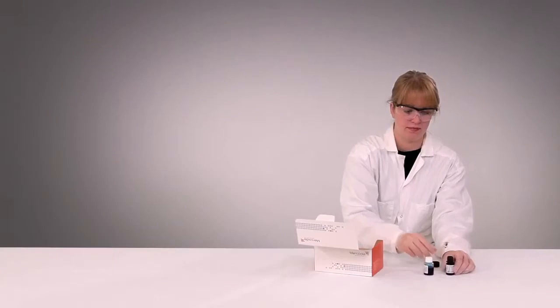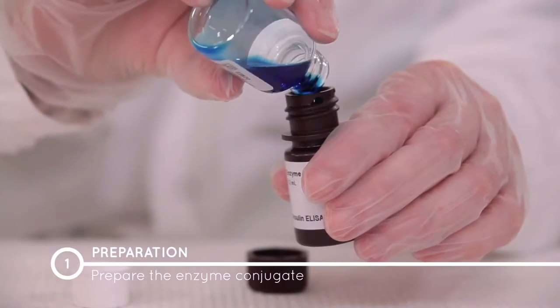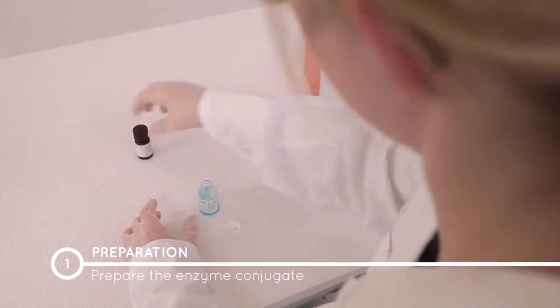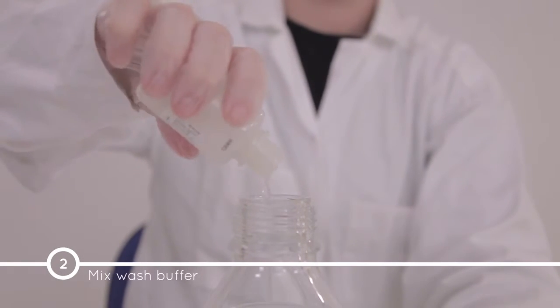First, prepare the enzyme conjugate 1X by adding the enzyme conjugate buffer directly into the enzyme conjugate 11X vial. Use the diluted enzyme conjugate within 1 day. Prepare the wash buffer according to the specifications in the directions for use and mix gently.